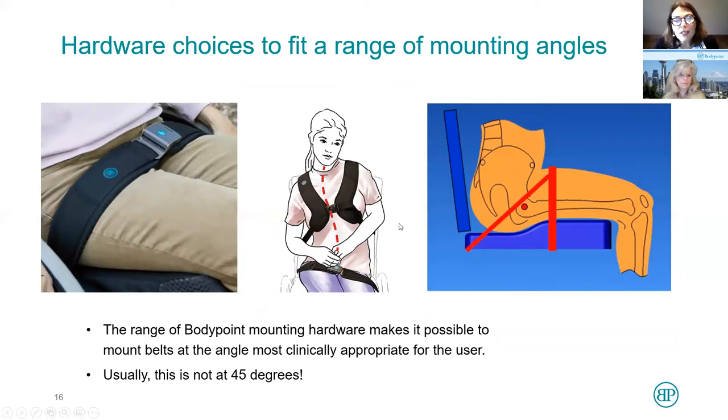In attaching these belts, this two-point belt is at about 70 degrees over the top of the thighs. When that's tight, it's much more comfortable than having it against the abdomen. With a four-point belt, the primary strap is right in front of the trochanter. The secondary strap — attached back at 45 degrees — is just to hold the primary strap in place. If you have someone with a lot of high tone, that's when you might use a four-point belt. Even in this configuration, the person can still lean forward and offload those ITs.